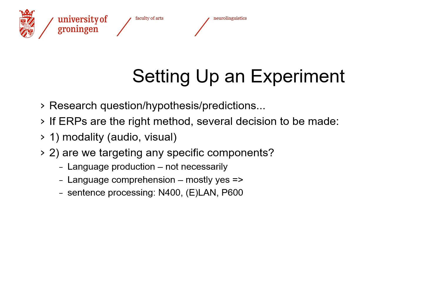I prefer visual experiments because data are cleaner, but audio experiments are considered to be more ecological because in visual experiments we have single word presentation, which is not the way we read. So that is really entirely up to you. Both are present in the field. Visual experiments may offer cleaner data and they may be simpler to set up. But this really depends on you and your research question.